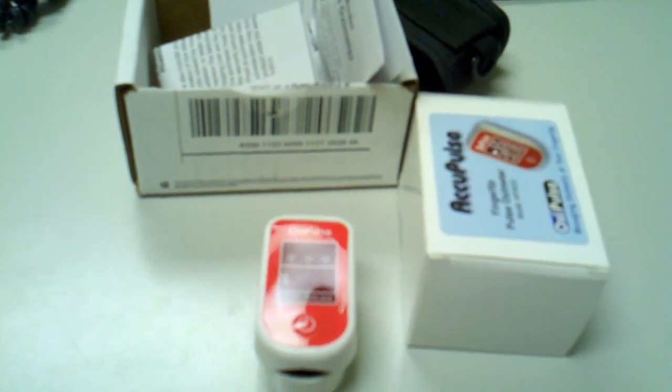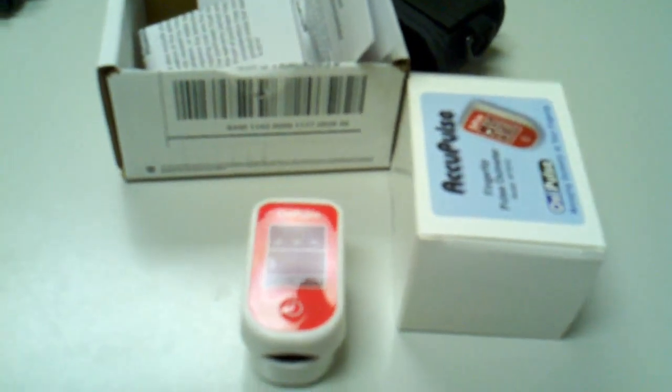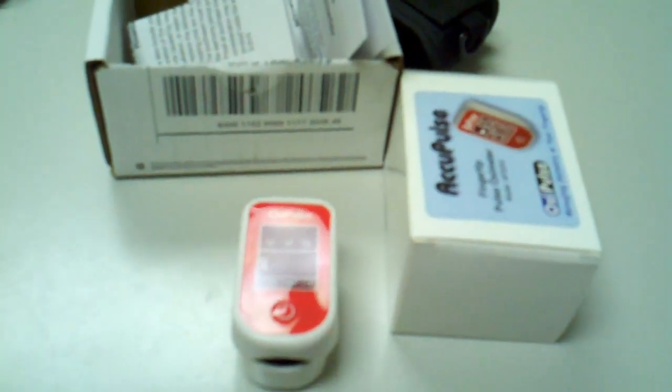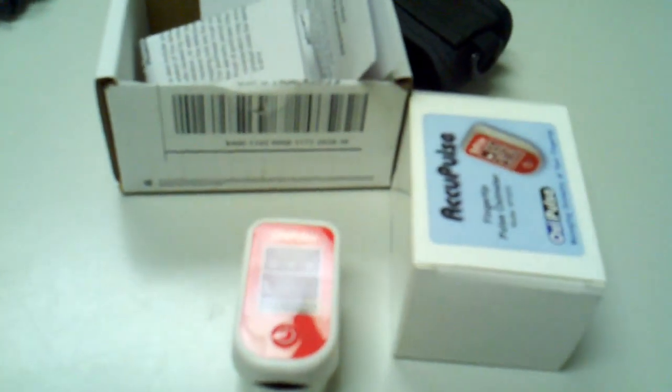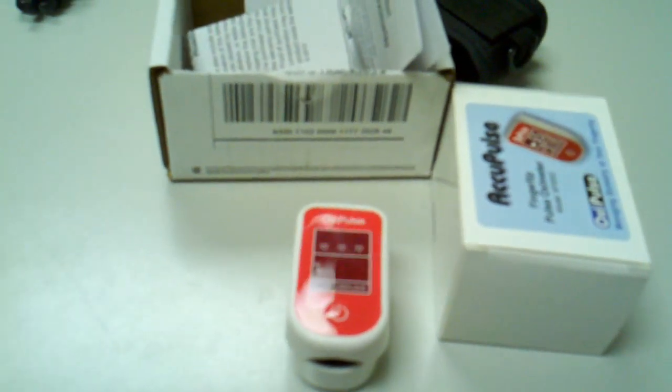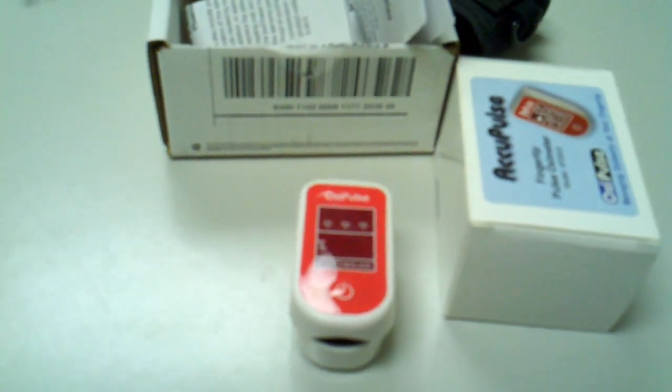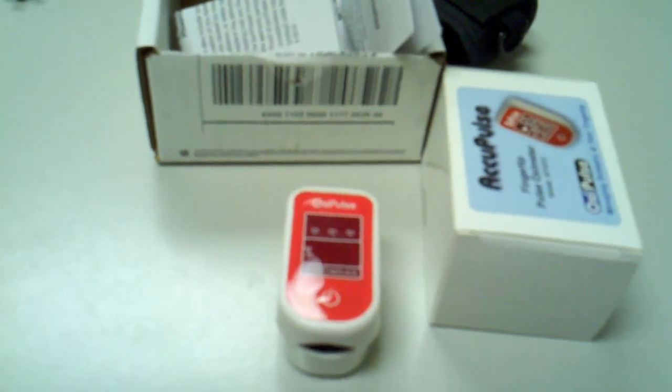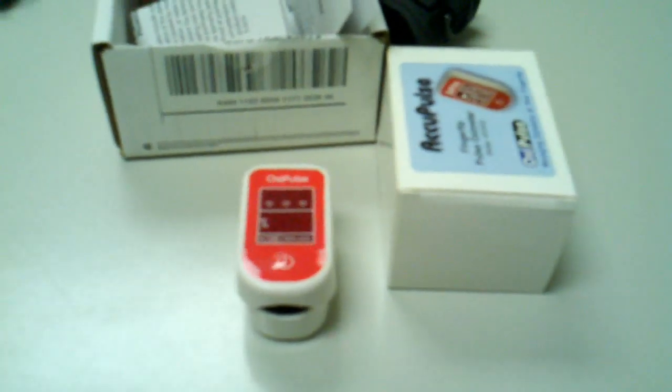This is the standard $49 one we have on our site called the AccuPulse, and what exactly you get when you order a pulse oximeter from GoSouthernMD.com.